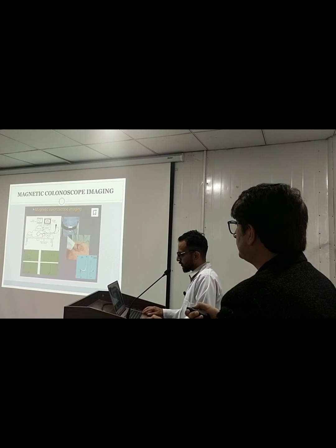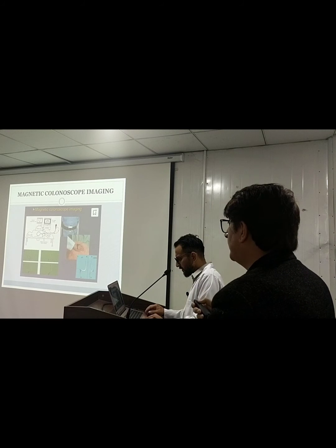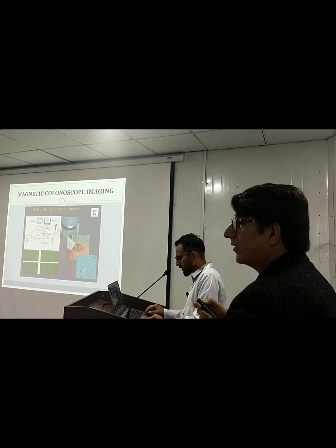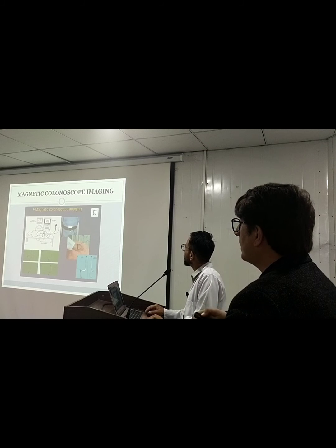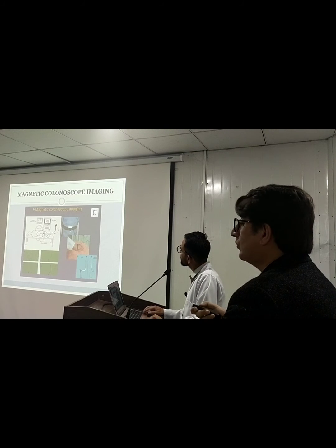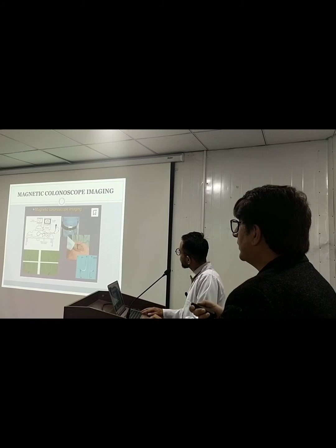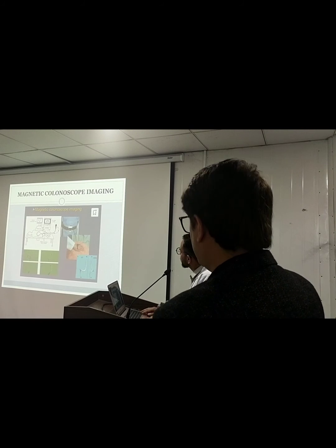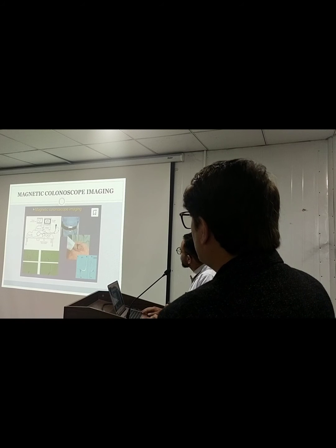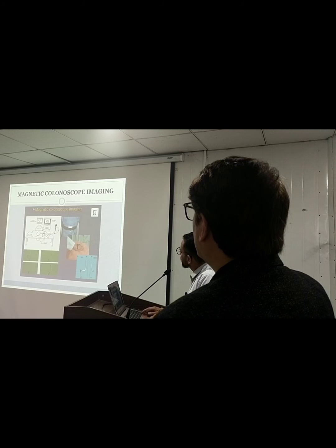Next is magnetic colonoscope imaging. So capsule endoscopy has a lot of therapeutic and diagnostic implications. We all know, particularly the lesions of the small intestine and those lesions not diagnosed by a conventional endoscope. Capsule endoscopy is especially useful for patients who are unable to tolerate endoscopy. It is a good, modern diagnostic technique through which we can diagnose, and we can also go for therapeutic strategies accordingly. Yes, next.